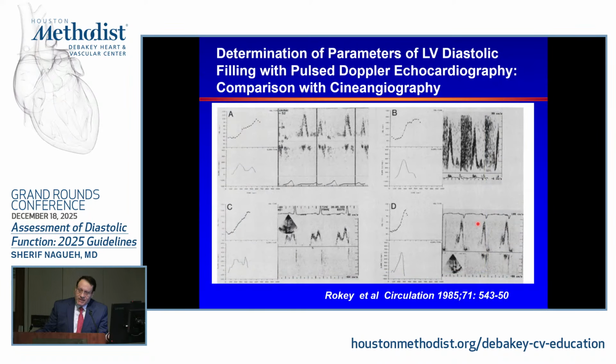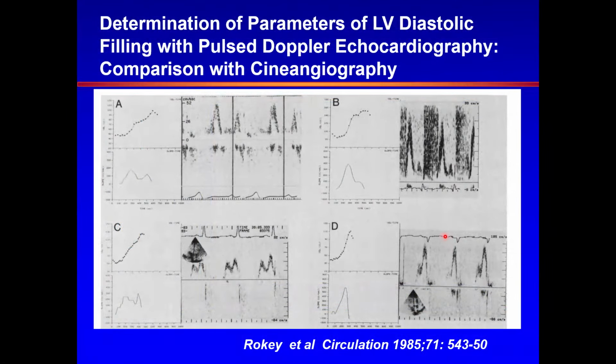So all of that is wonderful, but then the question comes, can that be studied non-invasively? And a lot of developments happened in the field of echocardiography, starting with M-mode, 2D. Pulse Doppler was a big development, and individuals were able to use the existing, at that time, ultrasound systems to get mitral inflow. This is early work from here, from Dr. Quinones, 1985, looking at the validation of these pulse wave Doppler velocities.